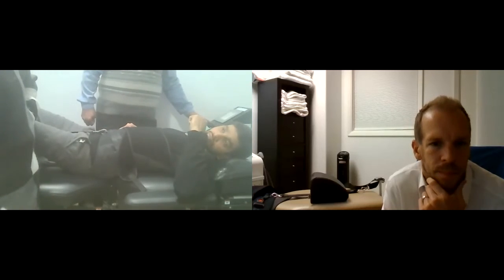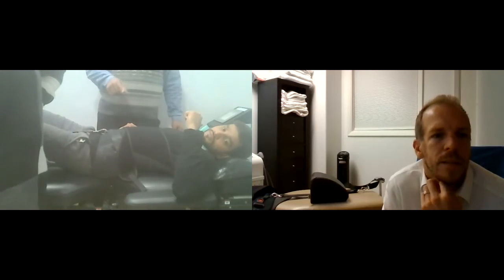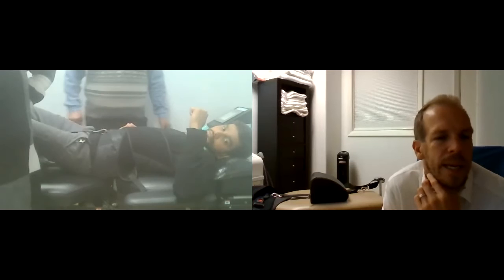Mr. Brian, day 1 will be 1 cycle. Yes. Correct. Day 2 will be 2 cycles. Correct. Day 3, 3 cycles. Correct. Day 4, 4 cycles. Day 5, 5 cycles. Yes. As long as you're not making them worse.